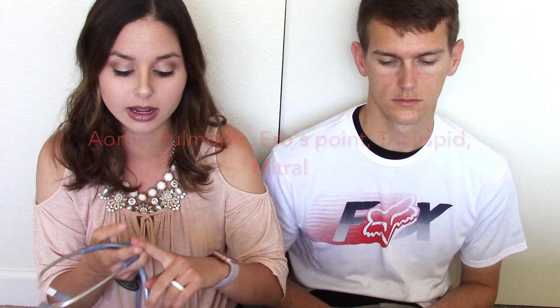The first thing you're going to need is a stethoscope and a patient, or you could listen on yourself. Basically there are a total of five spots that you listen to when you listen to the heart. There's an acronym called APE TM — it stands for Aortic, Pulmonic, Erb's point, Tricuspid, and Mitral. Those represent all of your valves except for Erb's point.